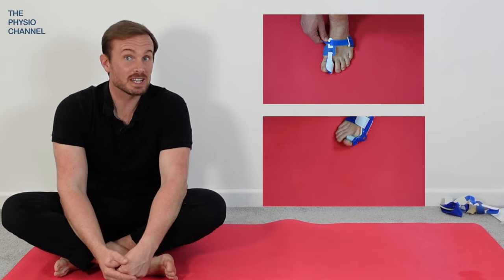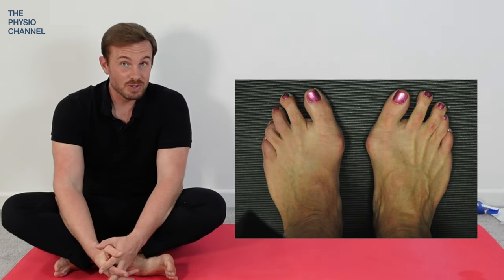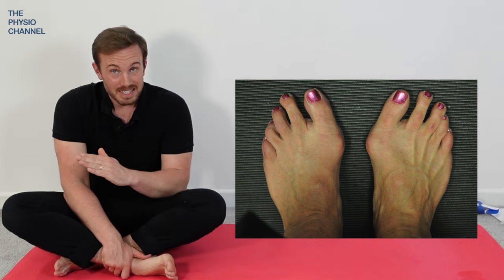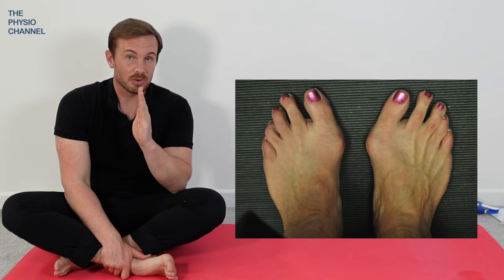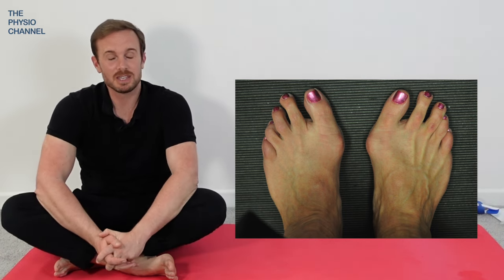So we're going to have a look at both the rigid and dynamic splints in this video. Overall, the research doesn't support the use of correctors having the ability to actually pull the toe across and correct it beyond the study showing two to three degrees being achievable.